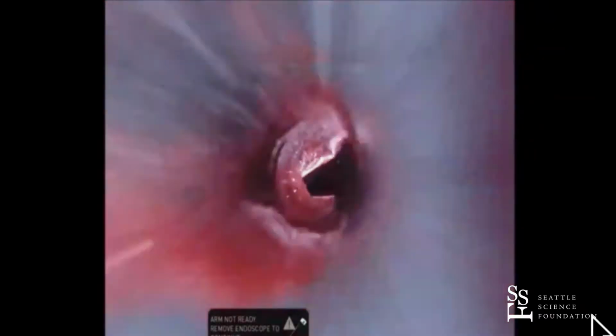That covers what the stitches are, how long they are, and the instruments, like the needle driver. I only switch the scissor to a needle driver and back, and that's probably the only change that tends to happen regularly anymore. Some people could change their left arm too, but that bipolar can suture with, so I doubt there are any other switches. But if you use Flow Seal, next thing you know, they don't have it and you want to put it in the defect. So these checklists are important.